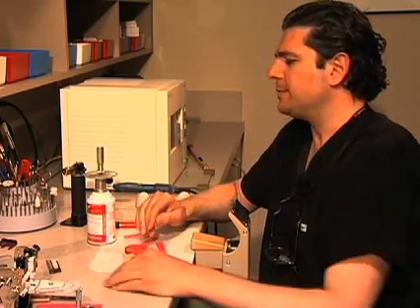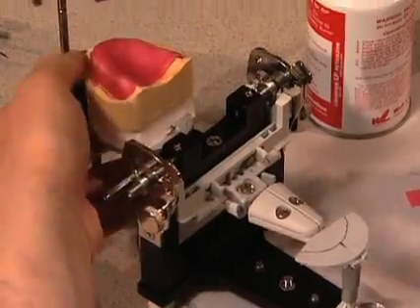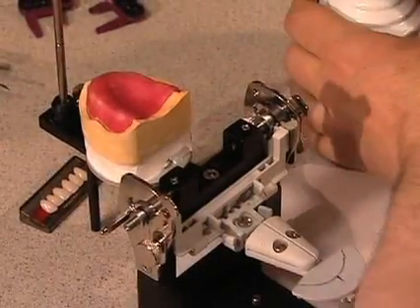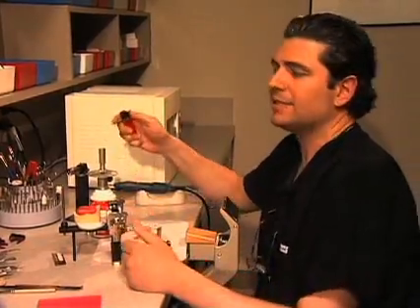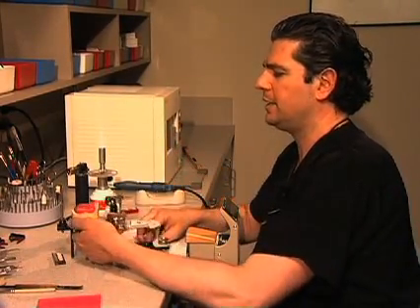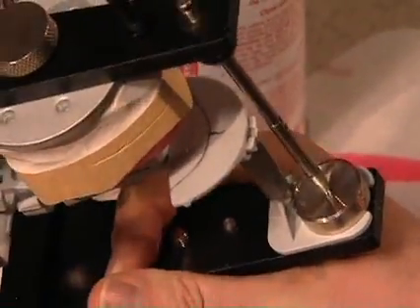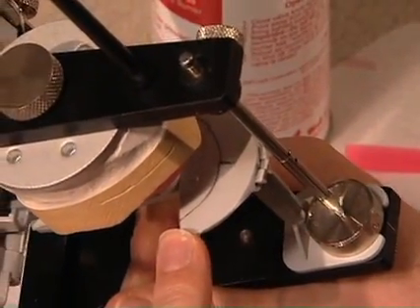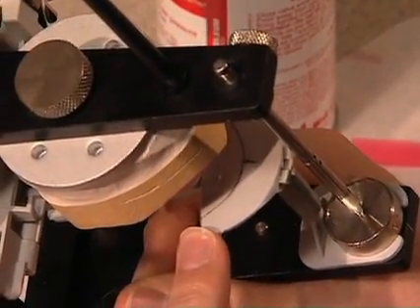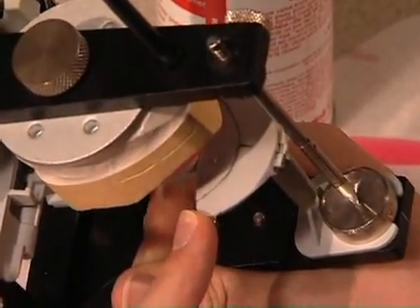So this is done freehand, and we're going to start the process right now. Charles was kind enough to make a second base plate — just in case something goes wrong, we've got the previous base plate to help reset any cast as needed. If you have a look at this articulator, Charles set up the incisal table with a little bit of sticky tape and scribed it with a lead pencil, indicating the midline and the rough position for the incisal edges of those upper maxillary anterior teeth.